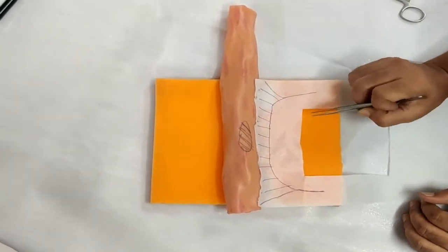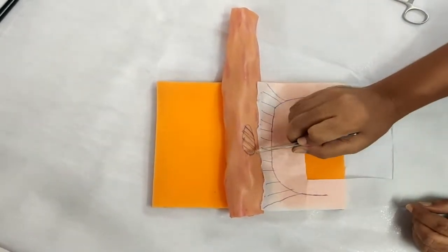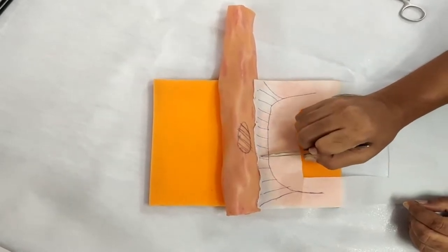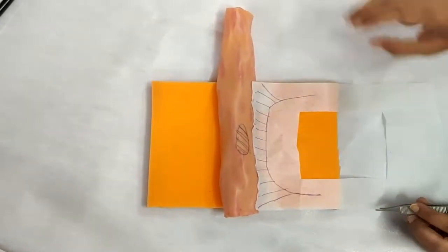Firstly, we need to identify which segment of the bowel we are going to cut. We have marked the segment on the intestine that we are going to resect.